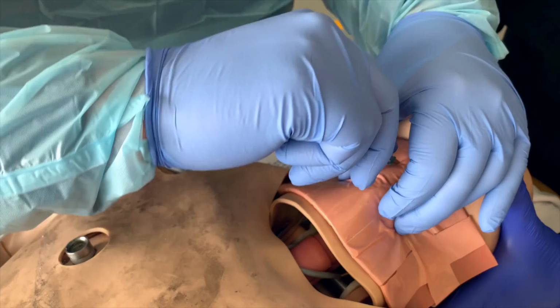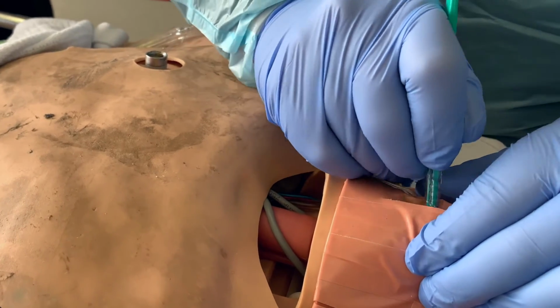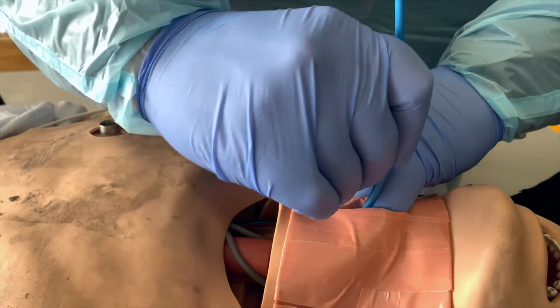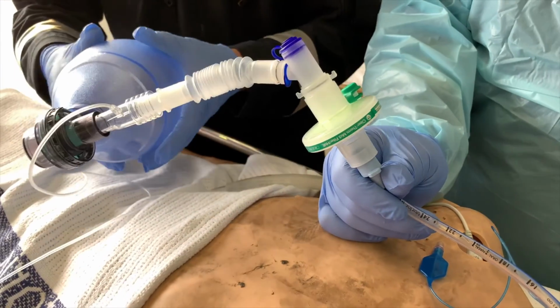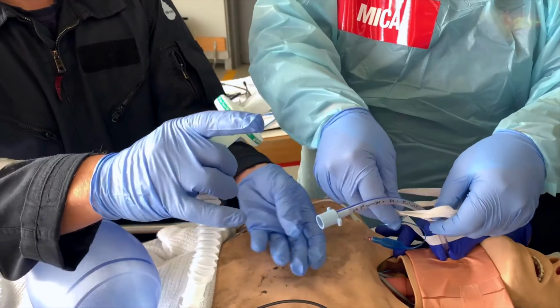Step 1. Identify the cricothyroid membrane landmarks, perform the incision and cut to air. Step 2. Dilate the membrane with your little finger and guide the bougie insertion down the trachea. Step 3. Railroad the ETT and inflate the cuff. Step 4. Commence ventilation, confirm placement by capnography waveform, and secure the ETT.